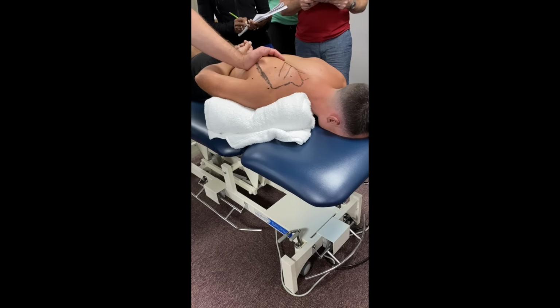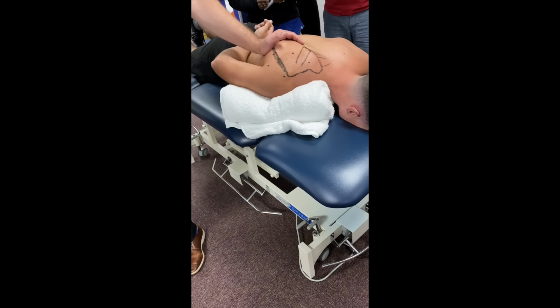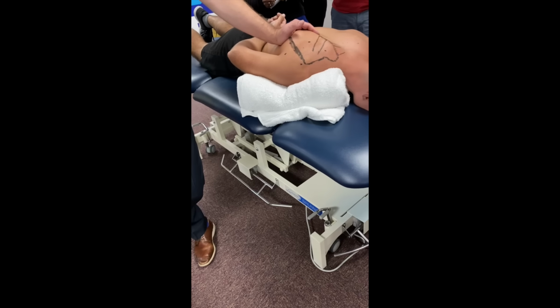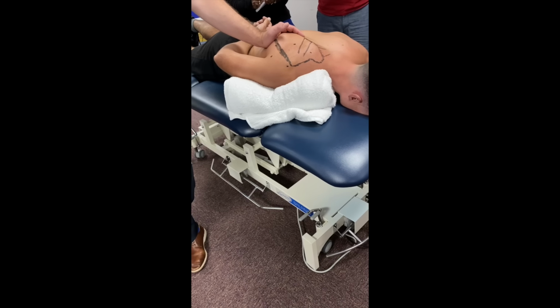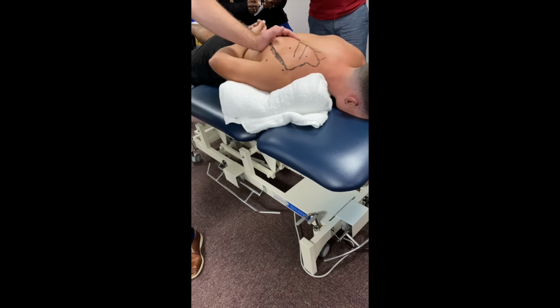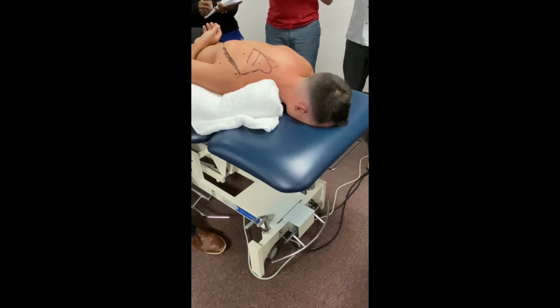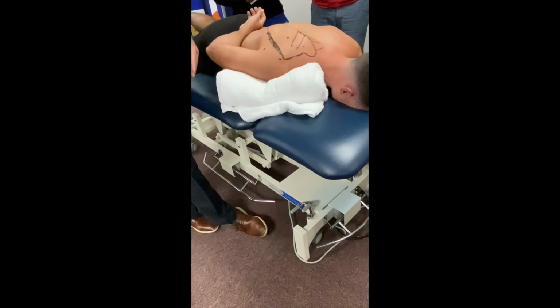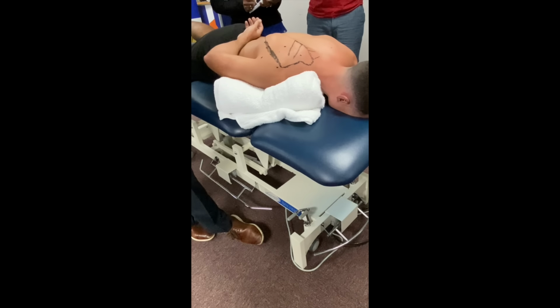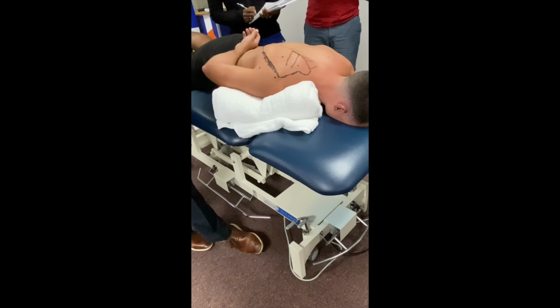This is not a place that you can just go for it. Okay. I would want to know before I just needle that vertebral border, like, what's the depth? How deep should I go before I know that I'm going to hit that bone, but no cigar, and in a place that I know is safe? I'm going to needle the back of the recess of the scapula, which is the back of the superior angle.